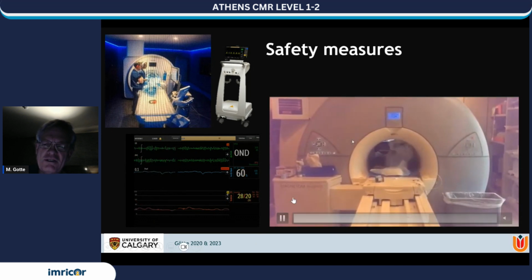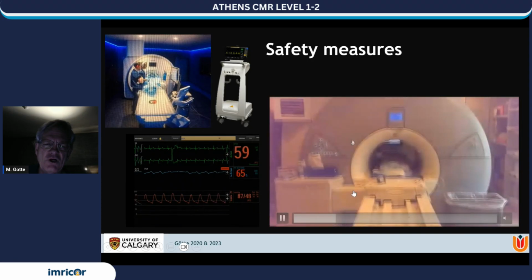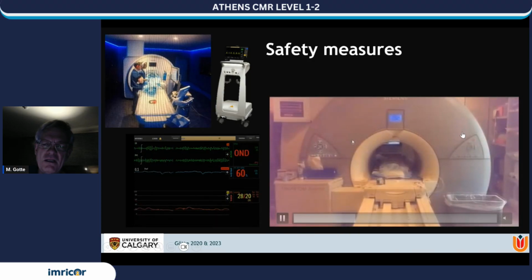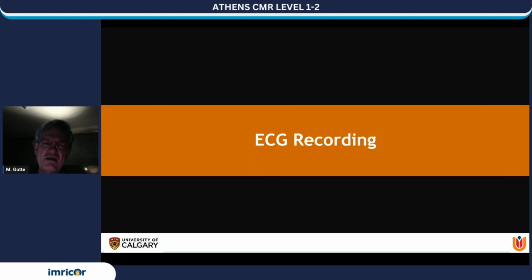Of course, this is not what you intend to do for a patient, but this experiment demonstrates that the defibrillator can charge and discharge, and give a shock. There are now better MR compatible defibrillators, which are not so associated with these strong muscle contractions. So we have a monitoring tool and an MR compatible defibrillator, which allows us to do more risky procedures associated with ventricular tachycardia and or ventricular fibrillation.